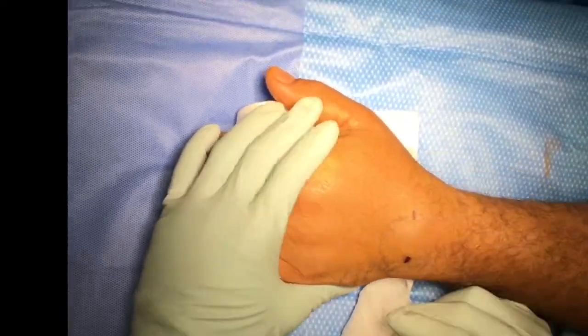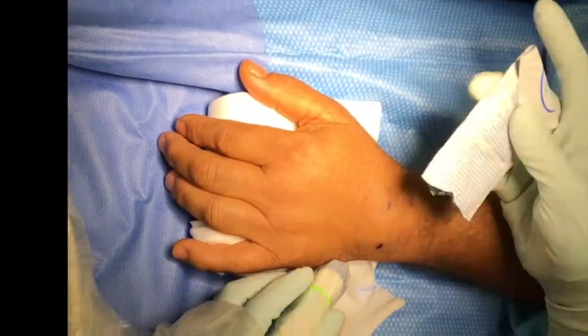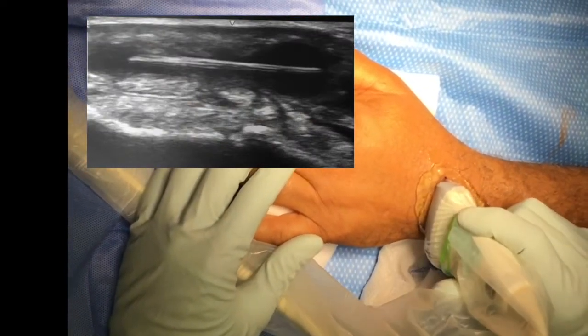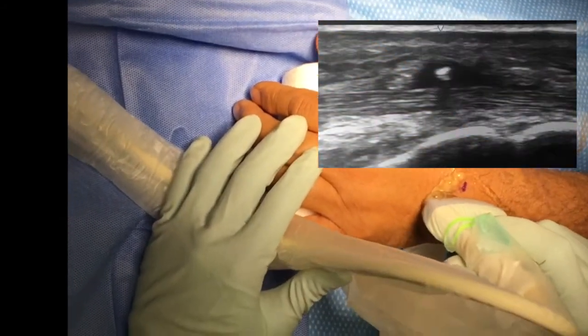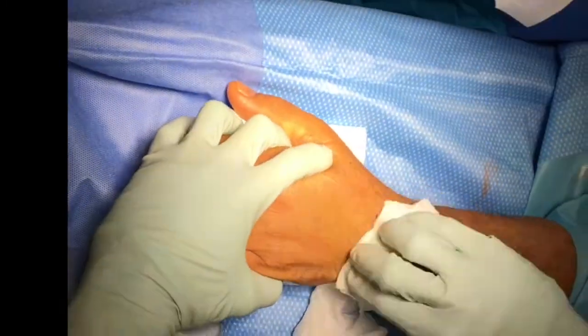At this point we slow down the video so you can see the ultrasound we're performing. The ultrasound is performed in both a longitudinal view and a cross-sectional view of the foreign body. This is the longitudinal view — you can see it's about two centimeters in length. And this is the cross-sectional view — you can see it's a pretty pointy and small diameter foreign body.